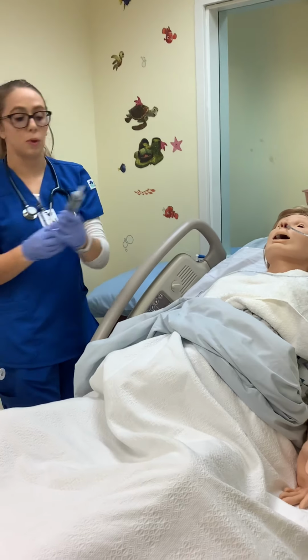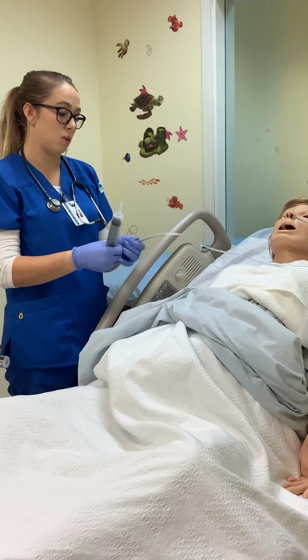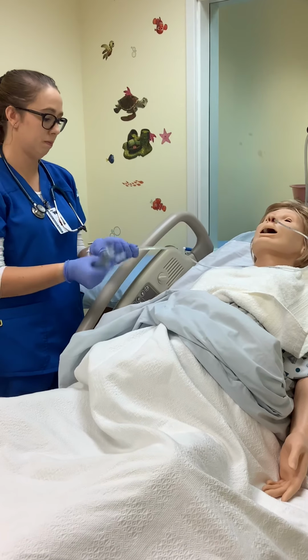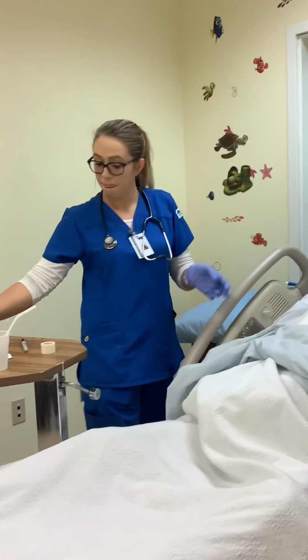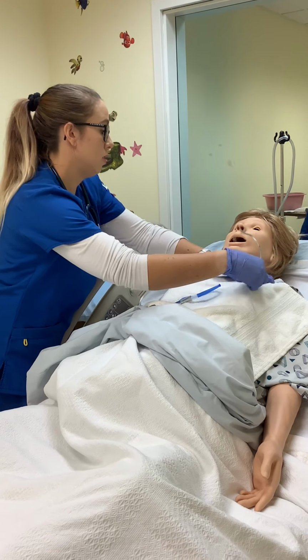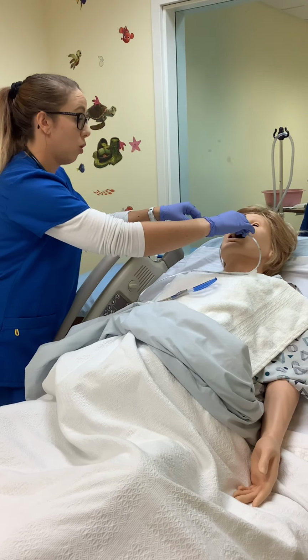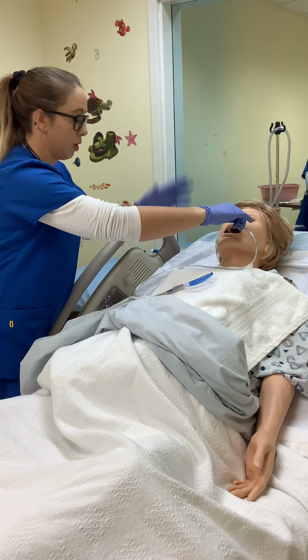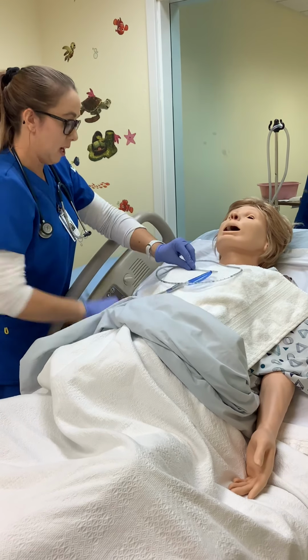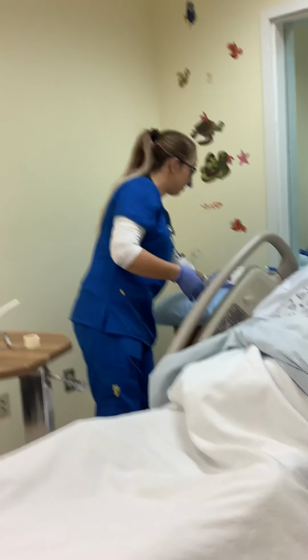Now what I want to do before I pull out is I want 10 milliliters of air, or sometimes they do saline, but for this video we are doing air to clear out anything that could be in the tube. Good. Okay, Shirley, so we are going to take it out of ya, okay? What I'm going to have you do is just take a deep breath and hold your breath, okay? And we're just going to rip it off like a Band-Aid, all right? So ready? 1, 2, 3, deep breath. And then making sure you're rolling it up and discarding it in a pad where the patient can't see.